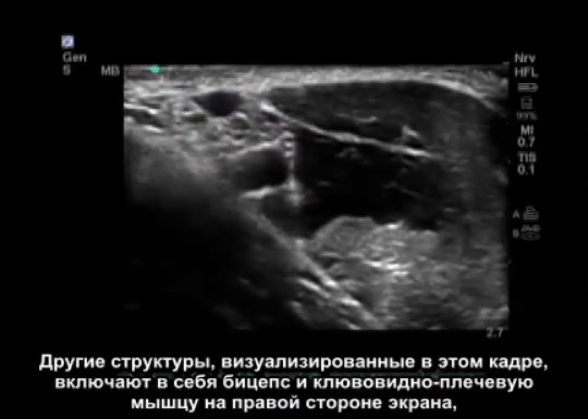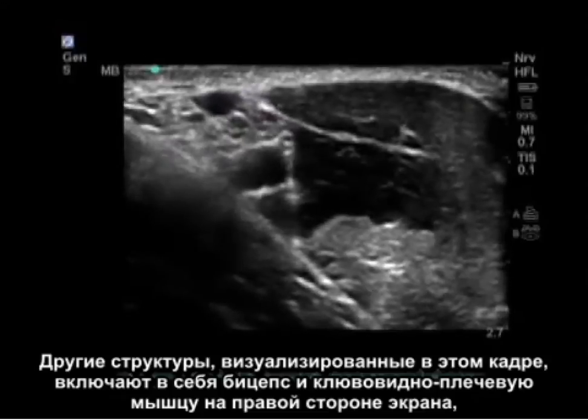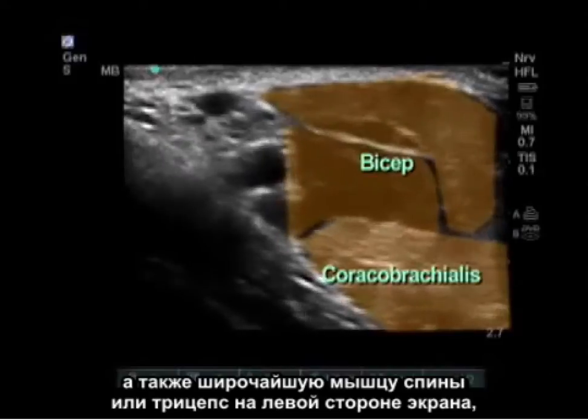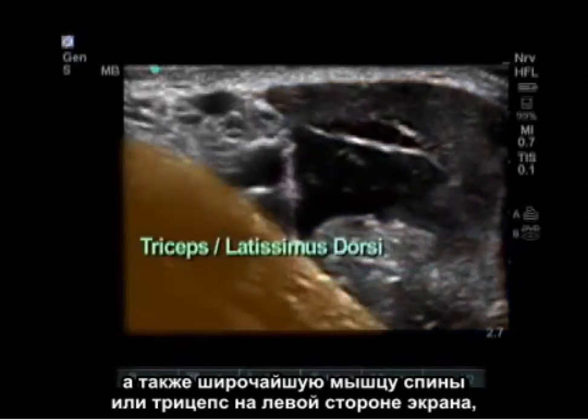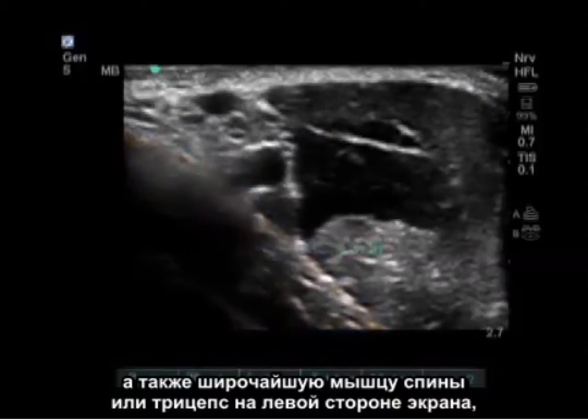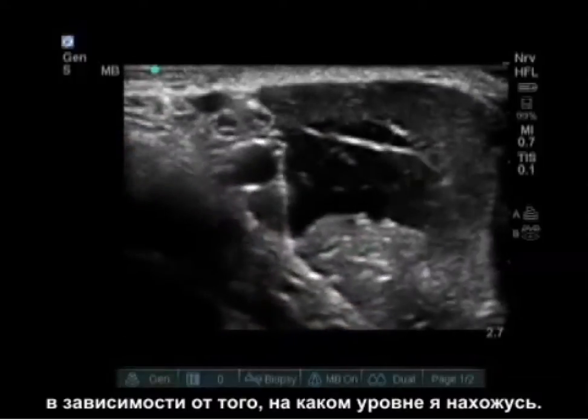Other structures visualized in this shot include the biceps and coracobrachialis on the right side of the screen, and either the latissimus dorsi or the triceps on the left side of the screen, depending on what level I am at.